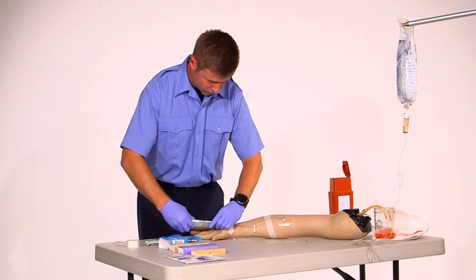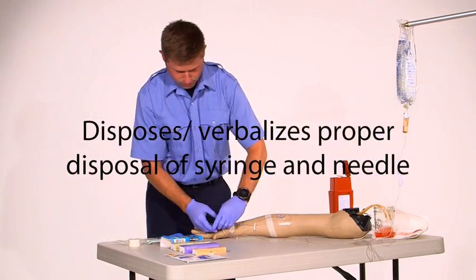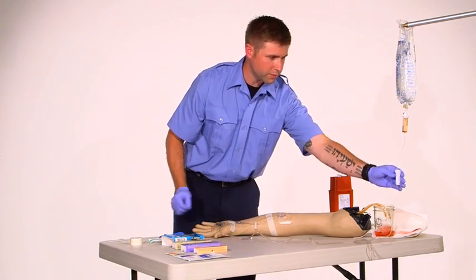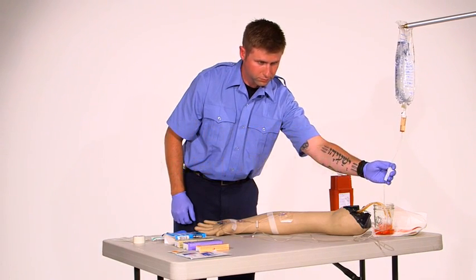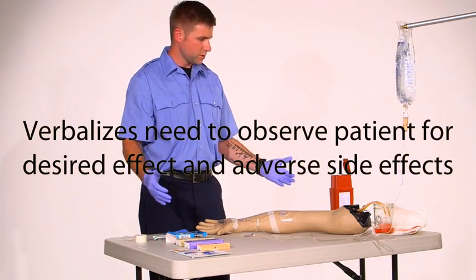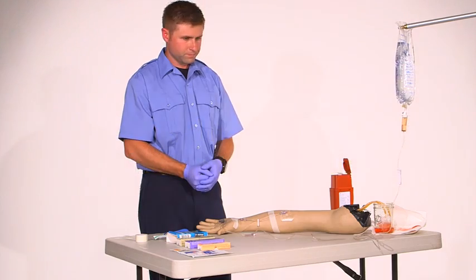Okay, push the dextrose. Open the line back up. Let the saline run. And I'm going to observe for any desired or undesired effects in my patient.